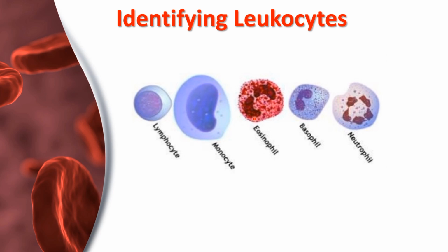This is an eosinophil. The nucleus of an eosinophil is spectacle shaped. It is bright red colored and bilobed. The connection between these lobes is slightly thicker. This is a basophil. The nucleus of a basophil is blue colored and bilobed. The connection between these lobes is very thick, which is not clearly seen, as you can see here.